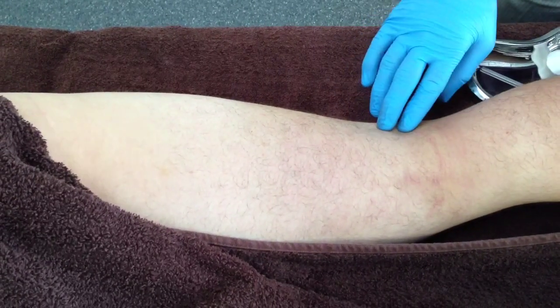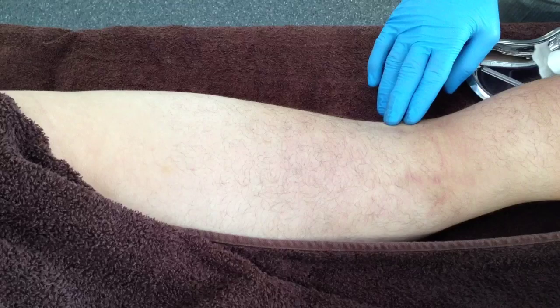Gentle, active, resisted knee flexion may be used to assist in the palpation of the lateral hamstring muscle belly.